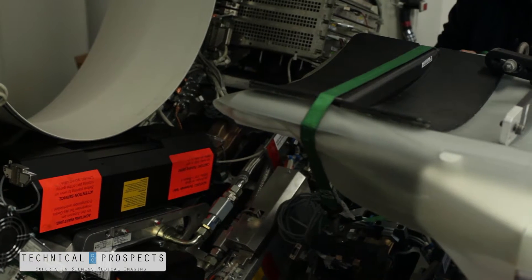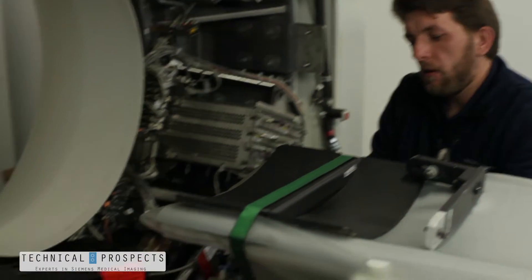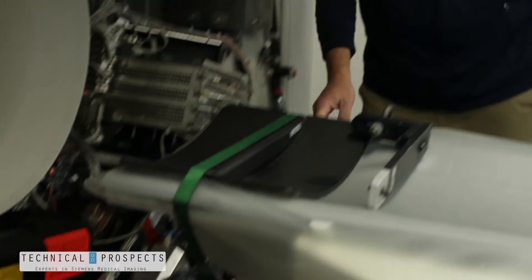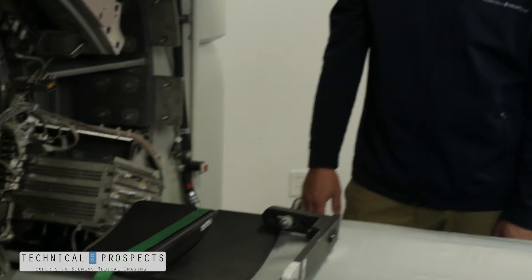Now that we have this in place we can put our table assembly into service. With the table assembly in service mode this allows us to drive the table up and down to help us lift heavy devices without any power to the gantry. This kit can also be used to install other parts such as HV tanks, E boxes, and other tube assemblies.